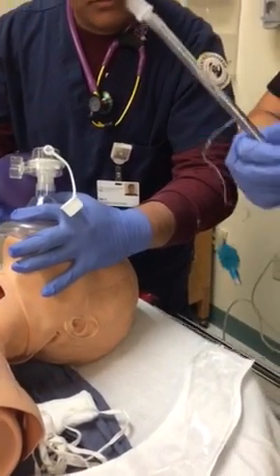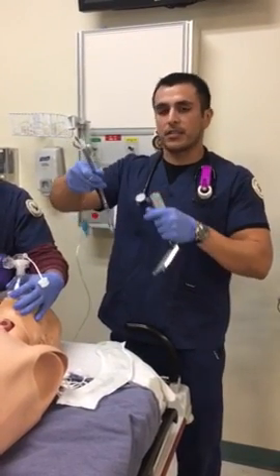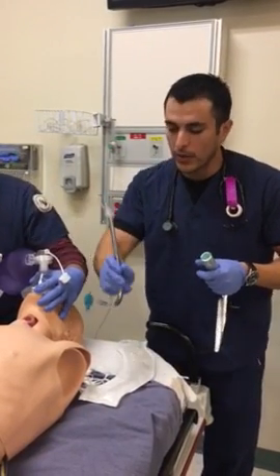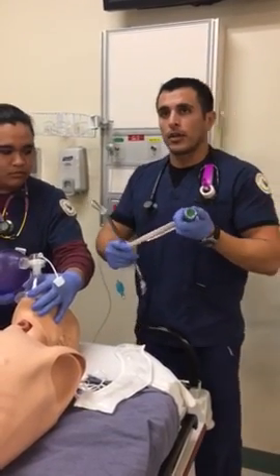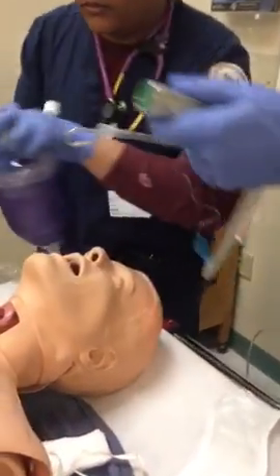Another thing you can do is angle the tube kind of like a hockey stick, so that it's easier to go into the airway, because if it's straight, it's going to be very difficult to get it in there. So you want to angle it like a hockey stick, so that when you go in, it just goes at that angle to get in. I let my partner know. We're ready in 3, 2, 1.